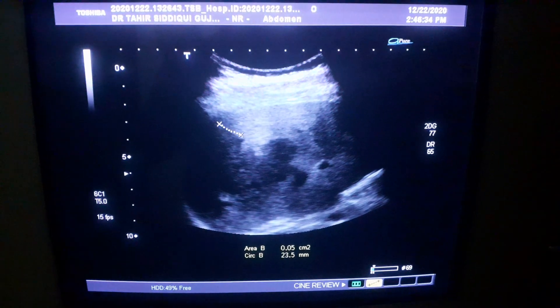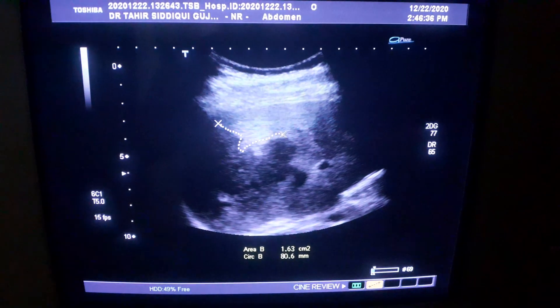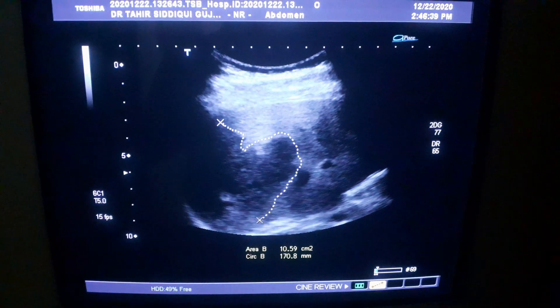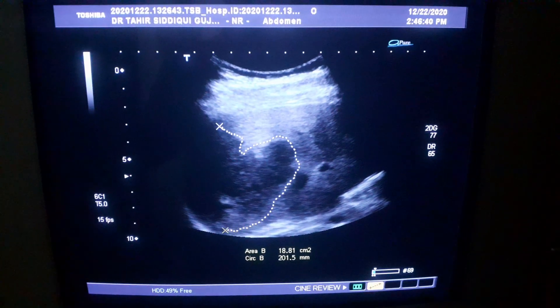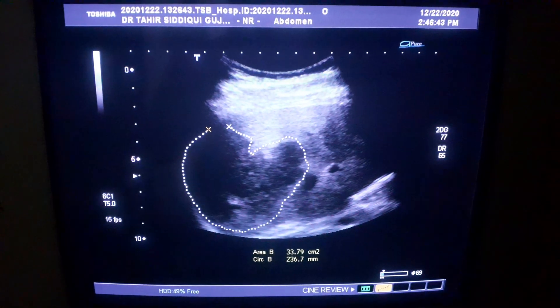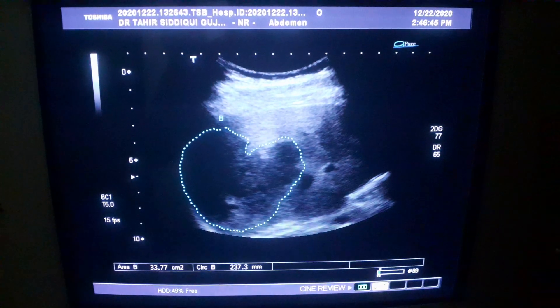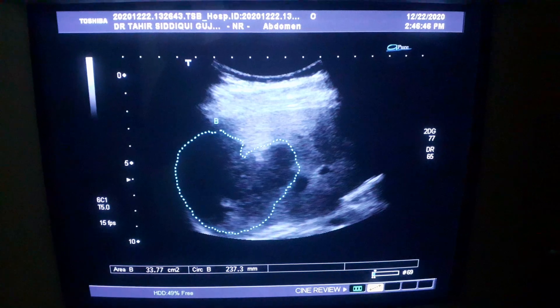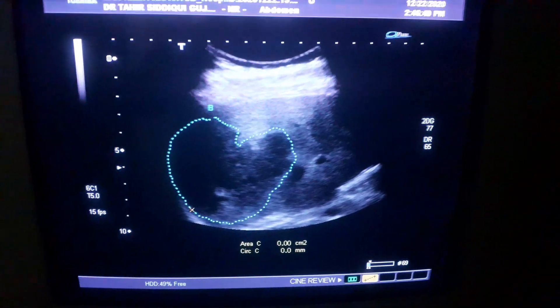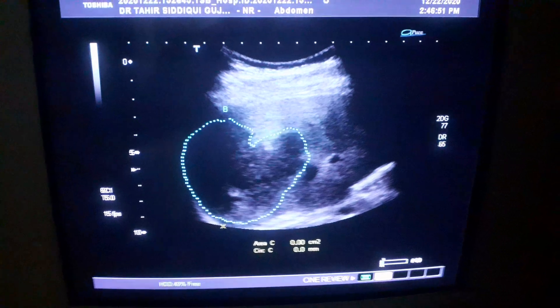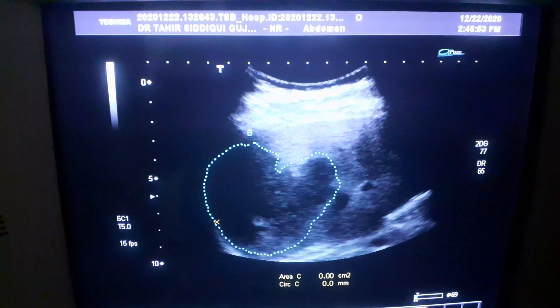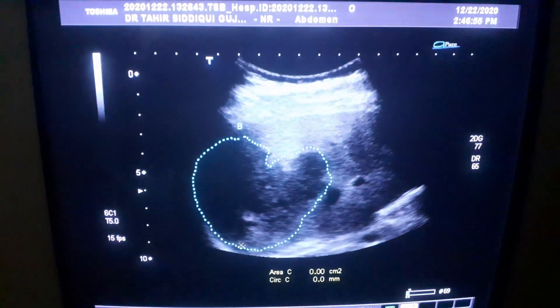You can see this one, this one, and this one. Now this is the diaphragm. The diaphragm appears thin in fatty liver — not that thick.